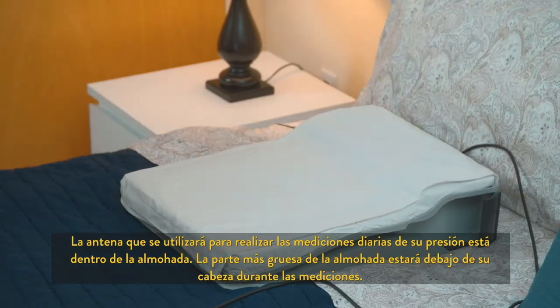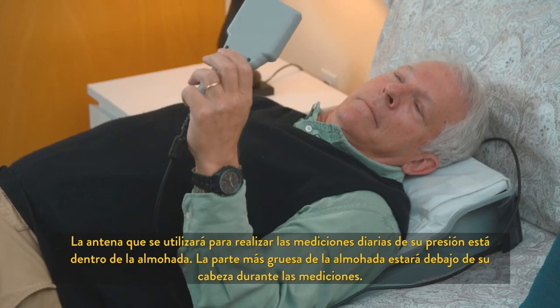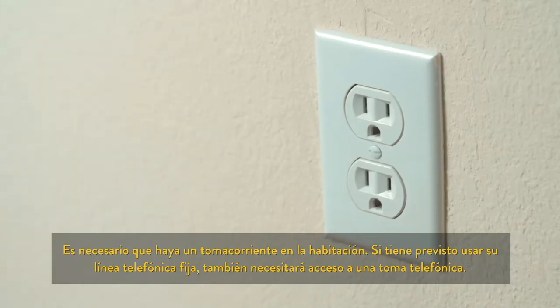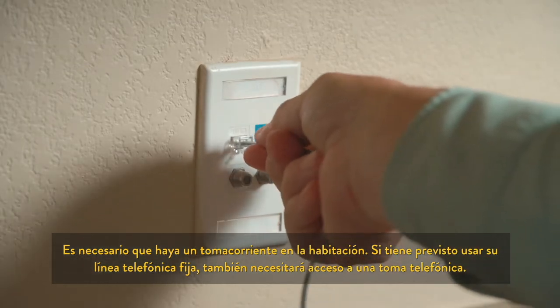The antenna that will be used to take your reading is contained in the pillow. The thickest part of the pillow will be under your head during the readings. The room will require a power outlet. If you are planning to use your home telephone line, then you will also need access to a telephone jack.